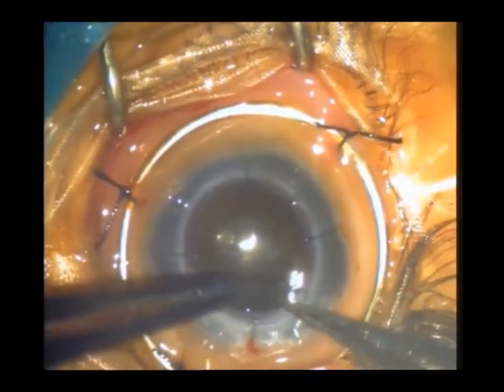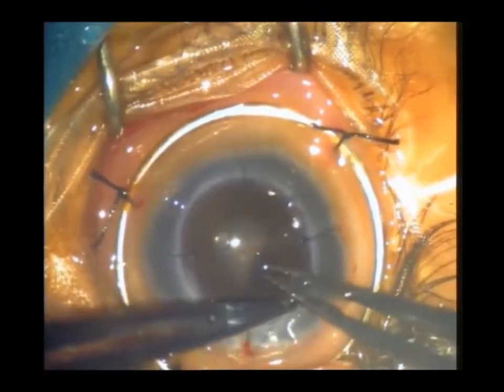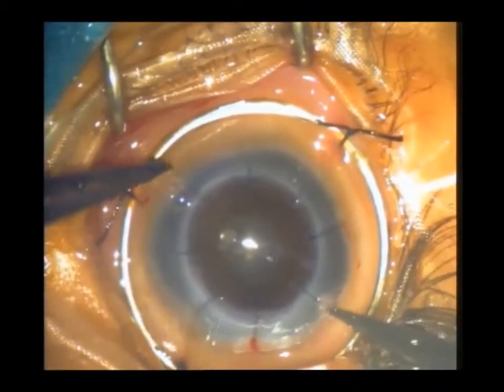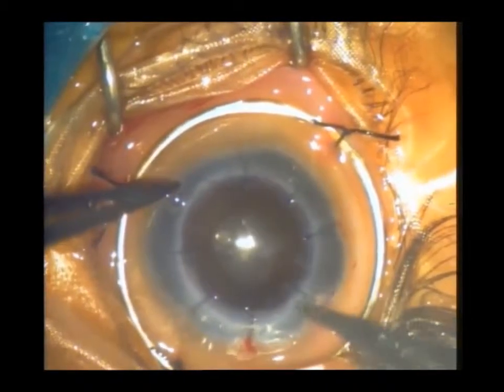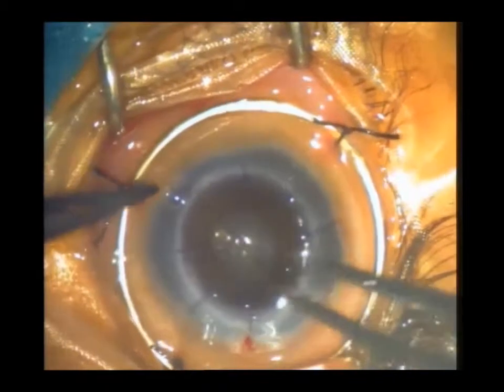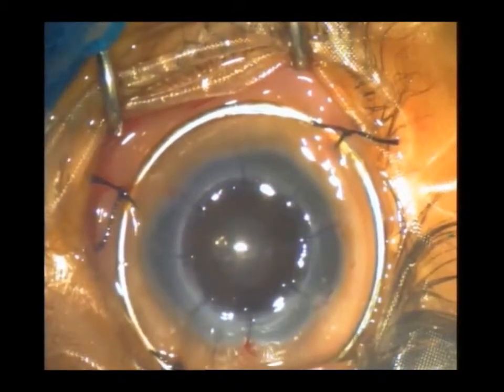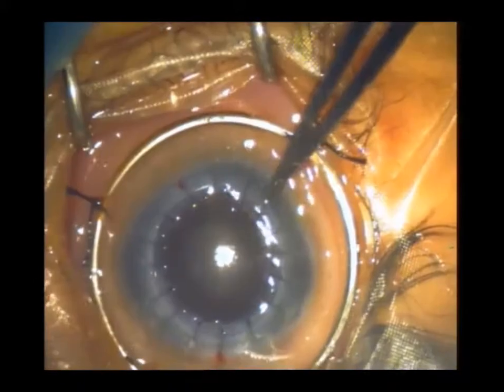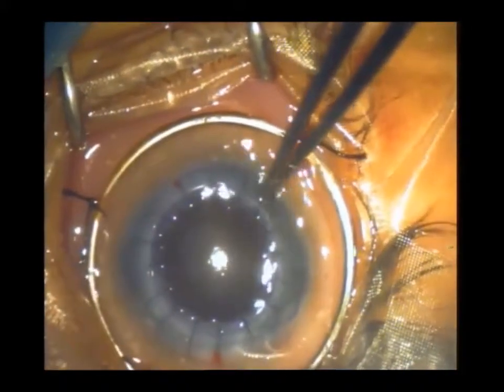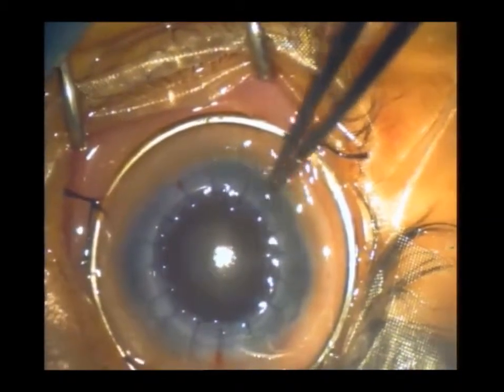The rest of the sutures are applied in a similar fashion in between the cardinal sutures. It's important to apply only interrupted sutures, as chances of loosening of sutures postoperatively are very high in the pediatric age group. Suture knots are then buried with the help of tying forceps.